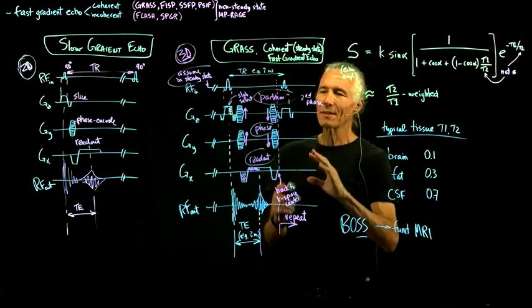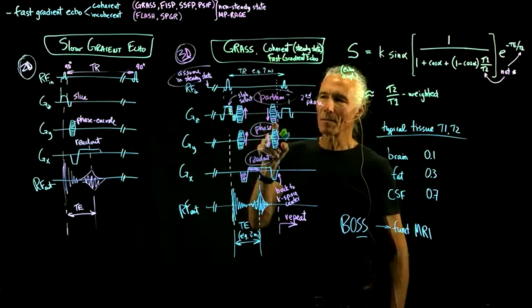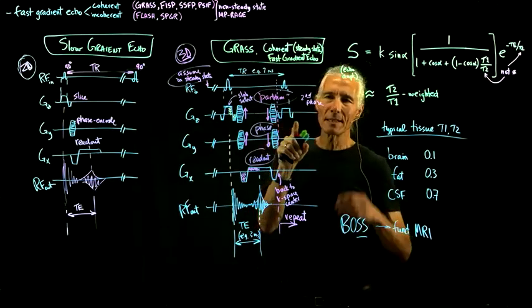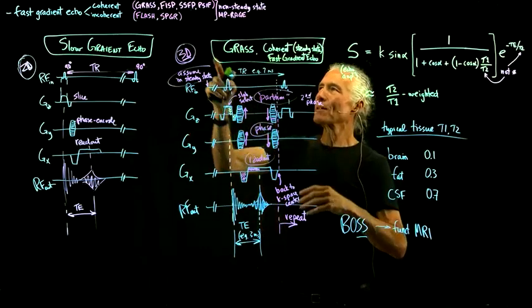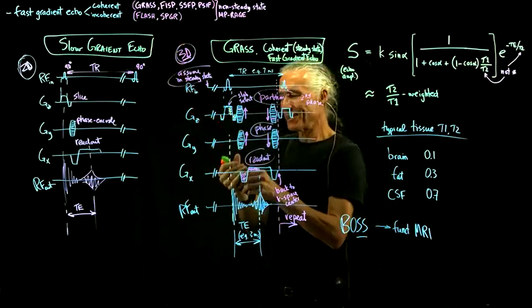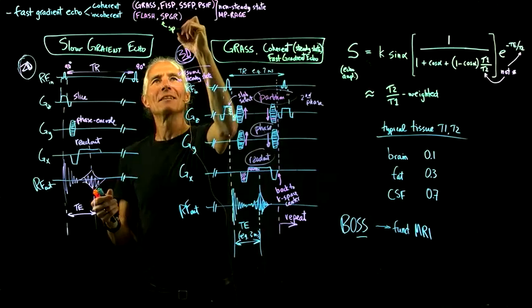So what are the issues with a sequence like this? Well, when you're doing this and patching up the magnetization, little imperfections in the gradients can lead to various kinds of artifacts, because with our standard MRI, a lot of times we just try to spoil, spoiled grass. What does that mean?